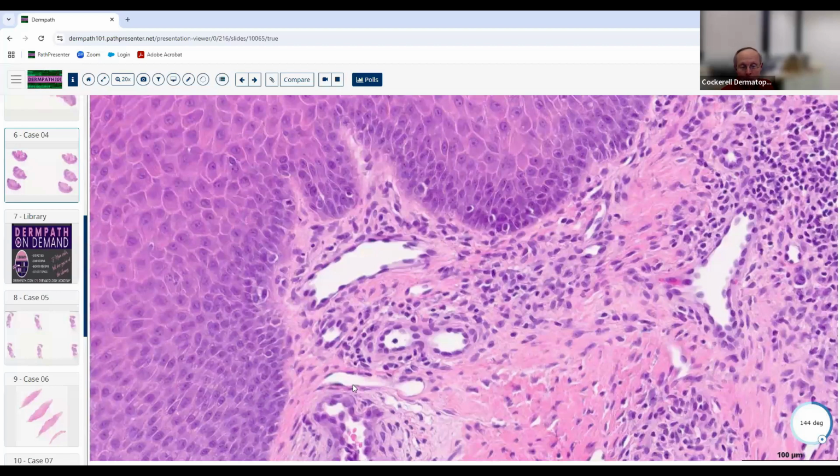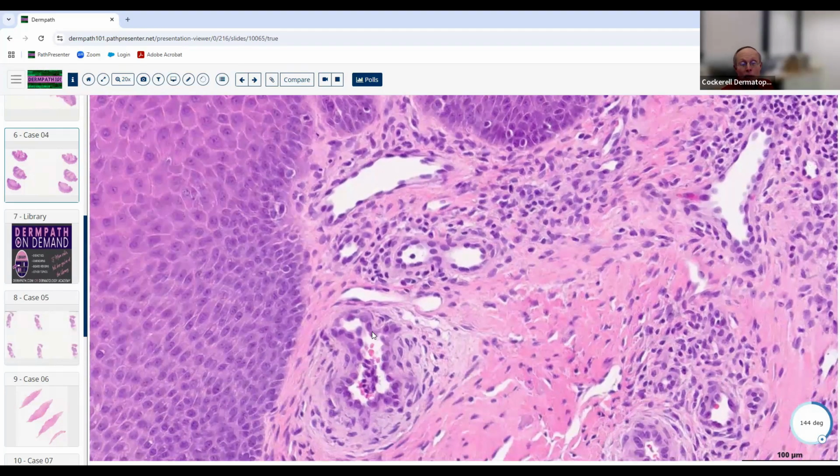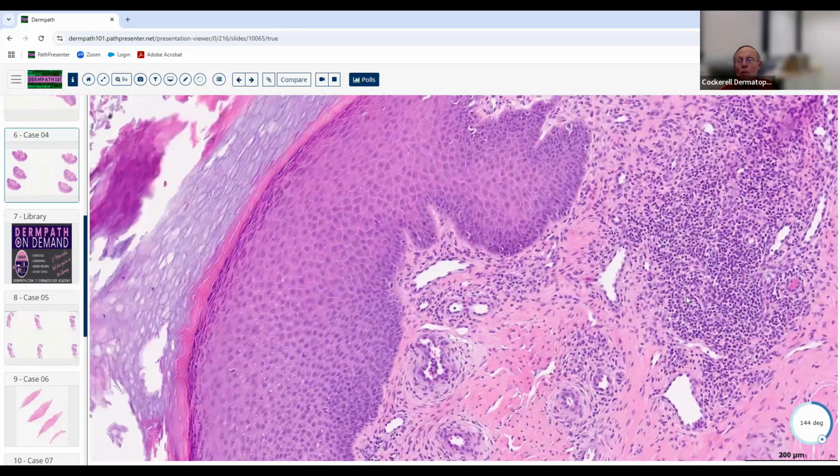These are normal endothelial cells. If I biopsied your skin and we looked at your capillaries, that's what they're going to look like. But this one sitting right next to it is abnormal, with a markedly thick wall and prominent, plump endothelial cells shooting into the lumen, so they're abnormal.